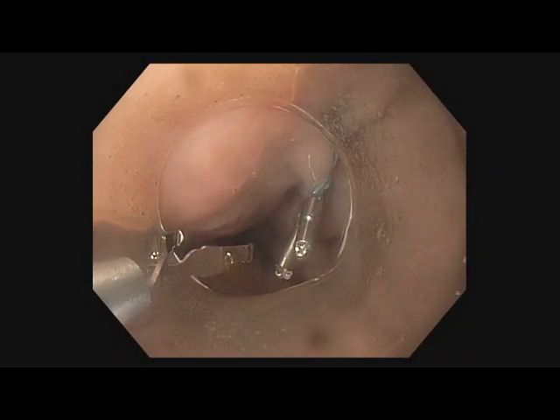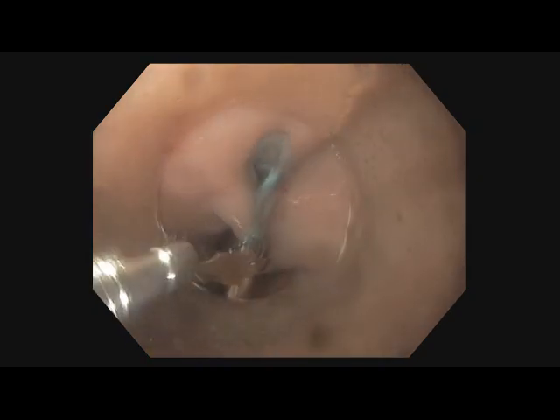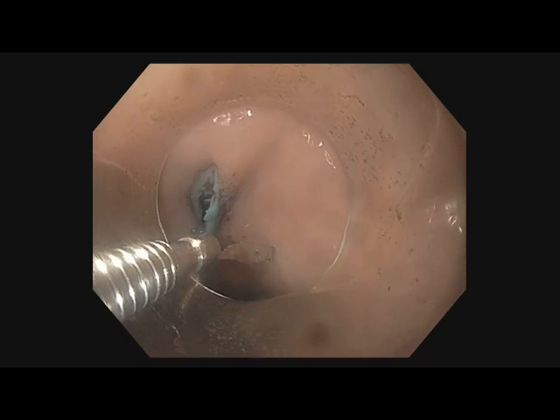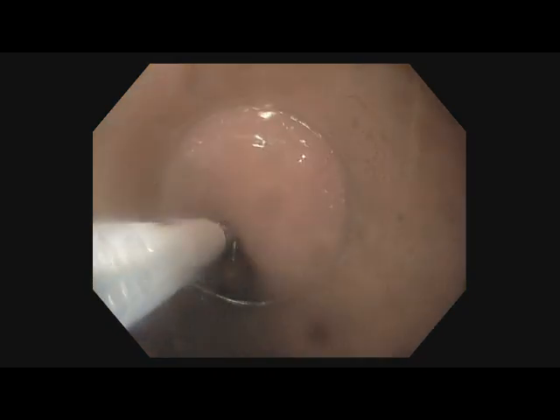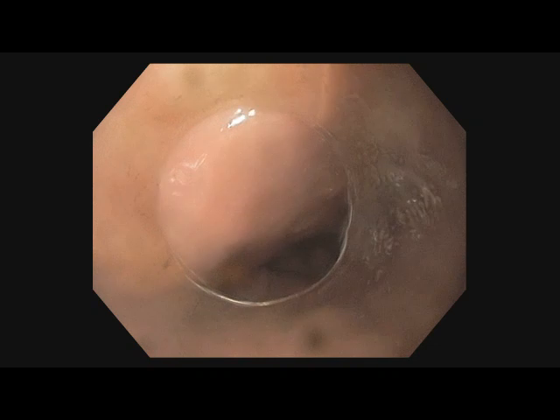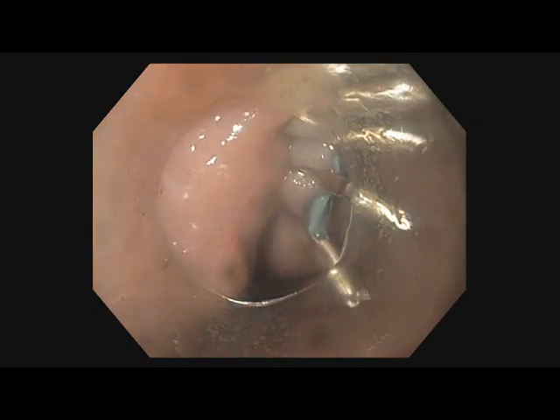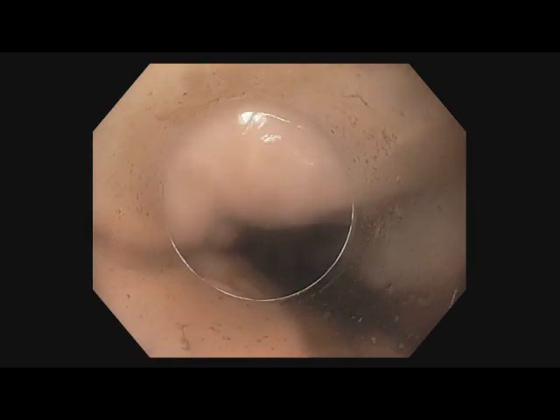After myotomy is completed, clips are deployed. After the last clip is placed, final endoscopy confirms the absence of full thickness injuries and the patency of the EGJ.